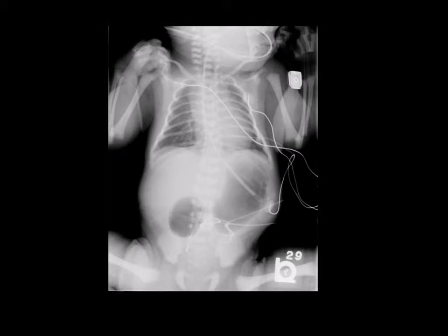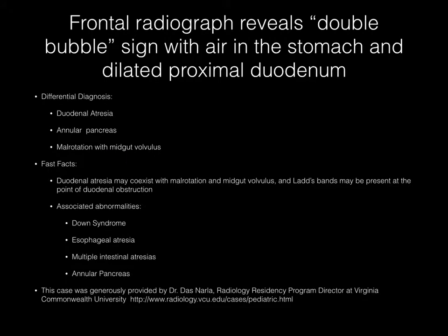Now pause your media player. This frontal radiograph demonstrates a prominent amount of air in the stomach and a dilated proximal duodenum — the so-called double bubble sign. This is somewhat classic for duodenal atresia, but annular pancreas and malrotation with midgut volvulus are also standard differential diagnoses given this appearance.